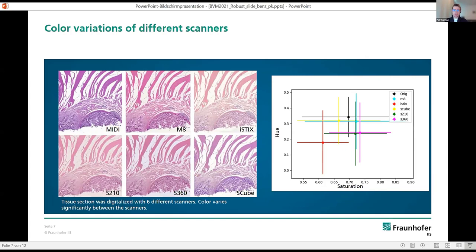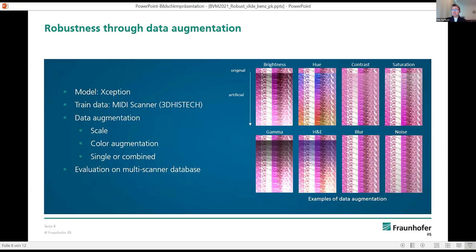The resolution as well as the color varies between scanners, as we can see on the next slide. On the left we see pictures from the different scanners — basically each scanner alters the original glass slide differently. For easier visualization we scaled each patch, so each patch looks different due to different resolution. They have pretty big variation in hue and saturation, which we can see on the right side.